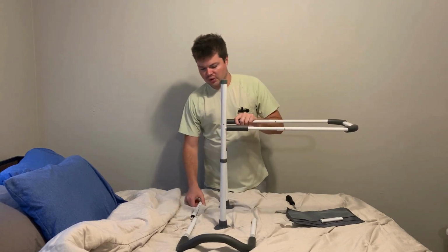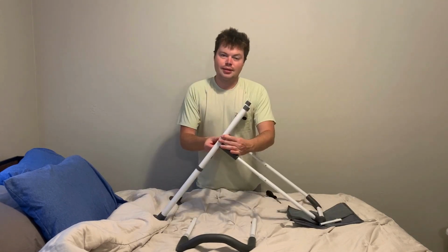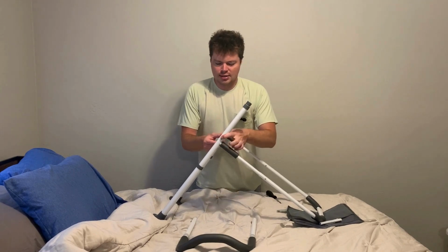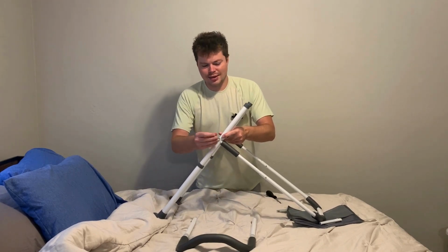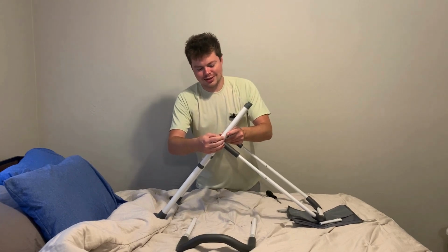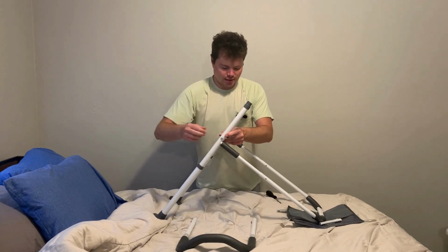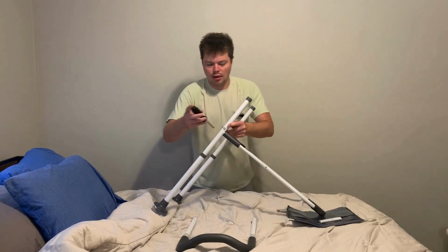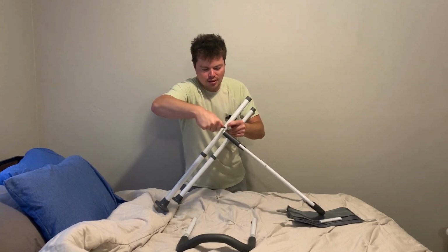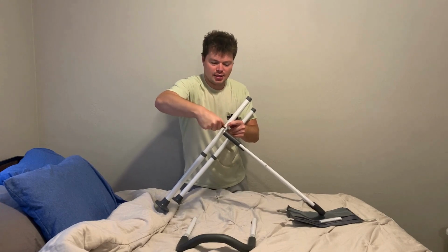use your screwdriver. So what you want to do is take your screws out, and to screw these into place is really simple. Just get that secured with your hand, and you can basically honestly get the screws in by hand without even using like a screwdriver. Obviously, you just want to use a screwdriver to get that final tightening on there, but they pretty much go in all by themselves. So even if you're not a handyman or woman, don't worry. It's going to be a really simple process regardless.